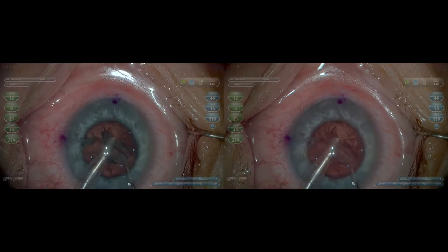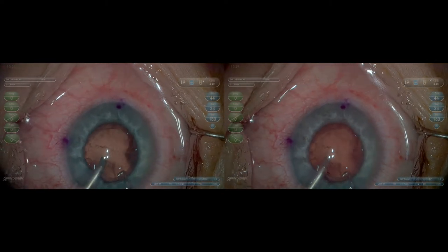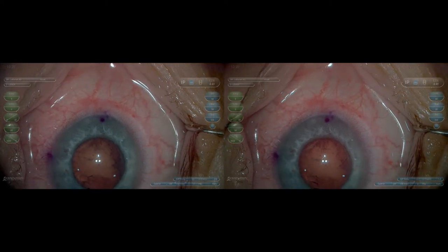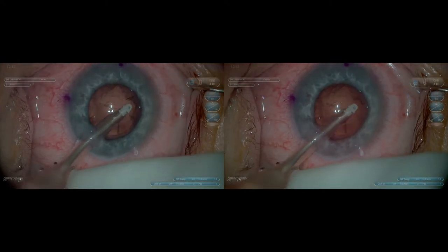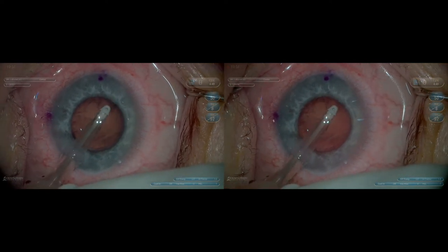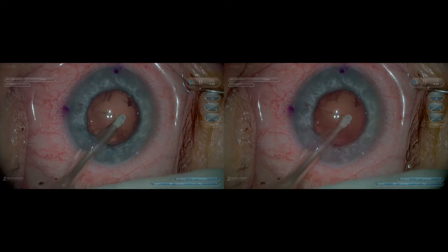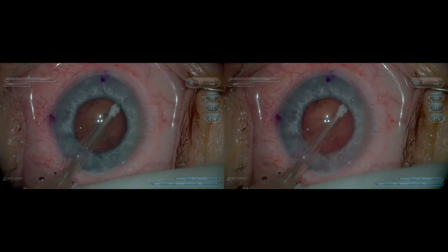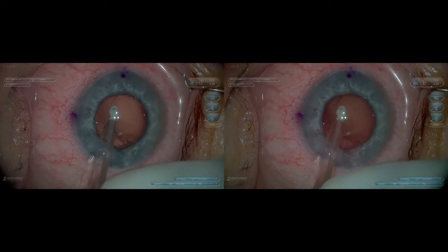It's interesting while I'm operating that I'm looking at a 55-inch monitor — everything is just magnified much larger as you're working. Sometimes with the advanced 3D visualization, you almost see too much. As I'm doing I&A and removing the cortical material, I'll see sawdust on the anterior capsule that I have to polish off. It also optimizes visualization of the posterior capsule so I can better polish these areas to best remove any remaining cortical material.